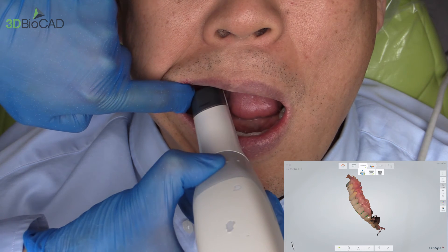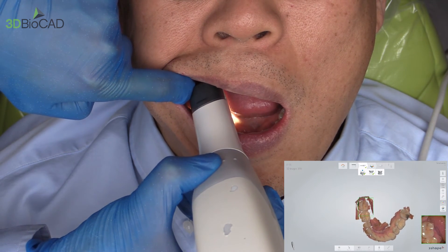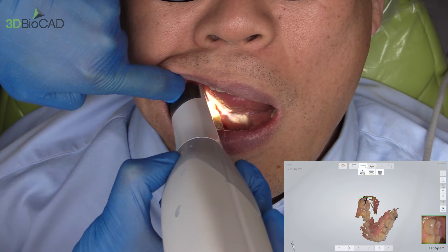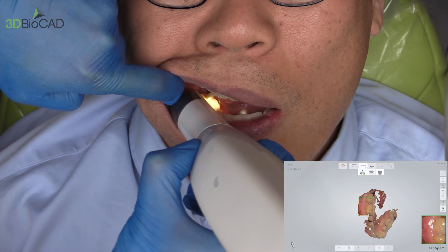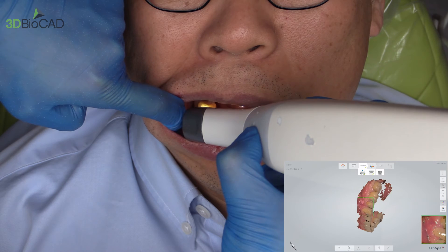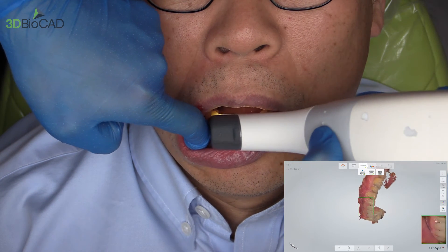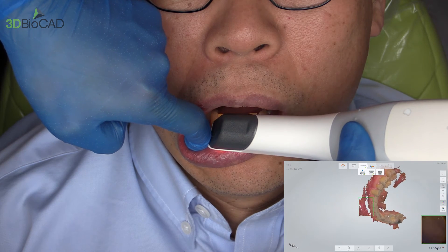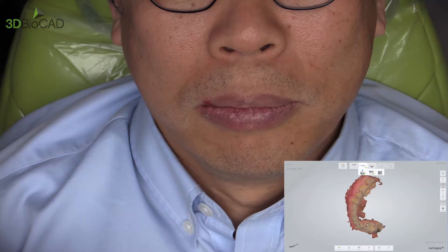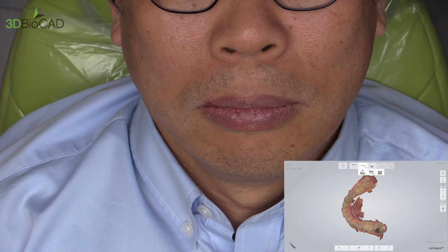Open please. As usual, start from the occlusal — the computer picks it up automatically. Rotate to facial and have the patient relax and bite down a little. Whenever the patient bites down or relaxes, it's a lot easier to scan. So now I have the lower as well.